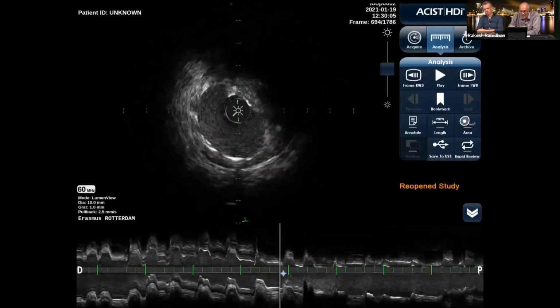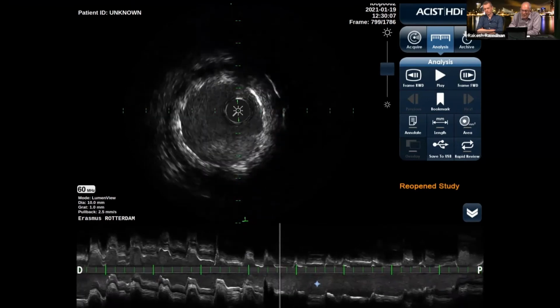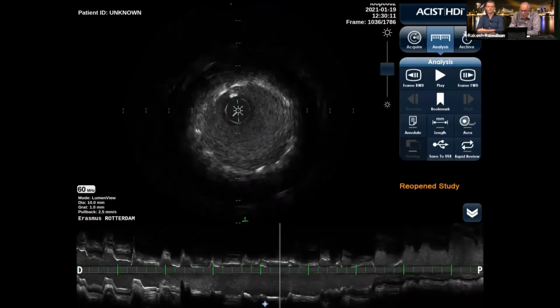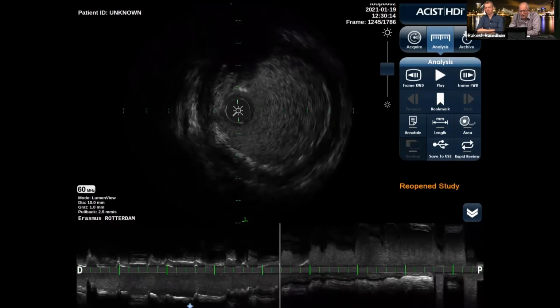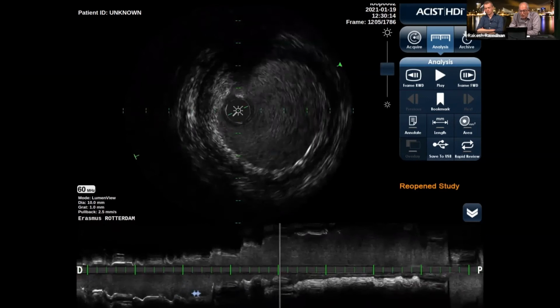And then a bit proximal, there we have a huge region of thrombus protrusion, and that is something that you may expect if we see this enormous amount of thrombus that we had to cover in large vessels, particularly. In large vessels, yes. And then here we have the stent well opposed, more proximal, and then we end in the proximal reference in there.